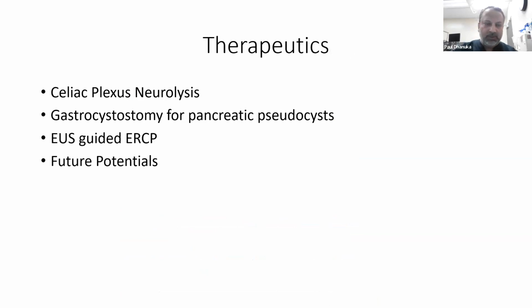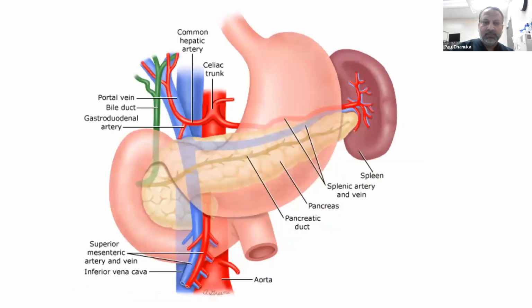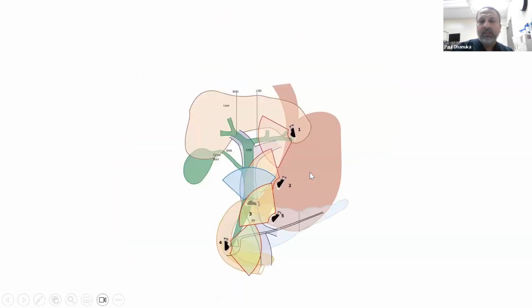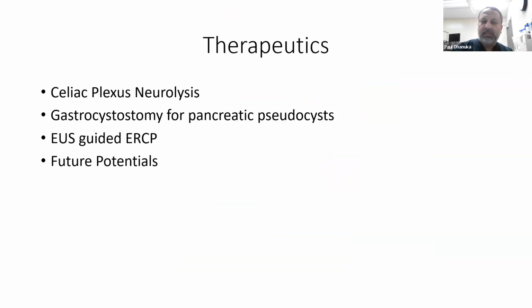EUS is also useful in therapeutics like celiac plexus neurolysis. And let me just go back to this image here, because around the celiac trunk, there are four ganglia, which are nerve ganglia, and pancreatic cancer can cause severe pain, and you can go in and inject those ganglia with absolute alcohol to kill the nerves and reduce the pain of the pancreatic cancer. This also can be useful for gastrocystostomy, for pancreatic pseudocyst.